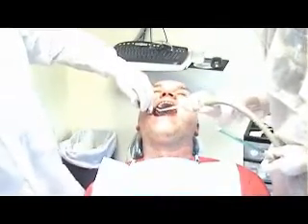All right, we're just going to wiggle back and forth. Nice and gently. You don't feel any pain, right Kurt? You're doing good. This is my cameraman, so I gotta take care of him — I promised him no pain at all. Here we go. All right, now let's get back in there and clean it up.